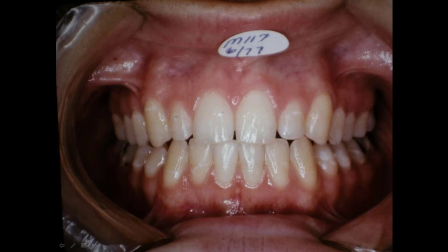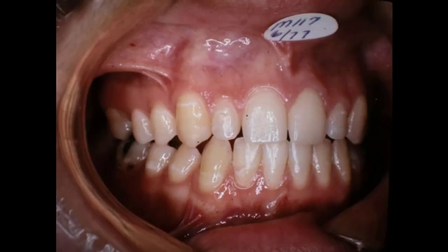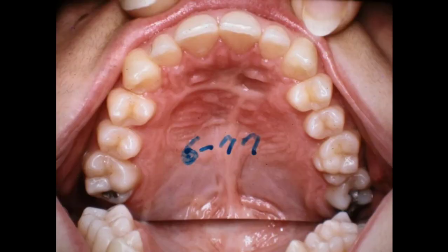She couldn't even have any dentures made later on with a palate like that. And you can do this with the appliances and the stuff that we have to work with today. From that side — 6 of 77 — you look down on this and it's looking pretty good. Everything's lined up — that's just a pretty good one. Not perfect, but good.